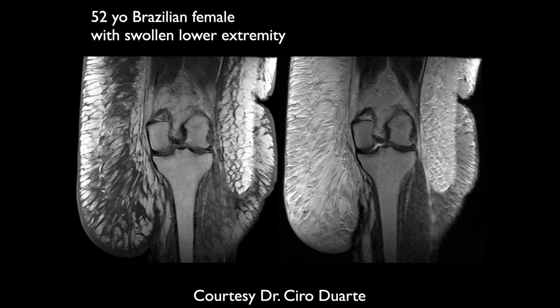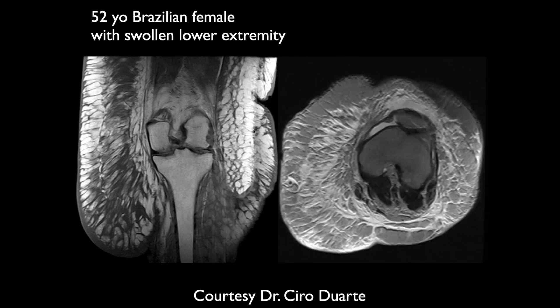Similarly, a 52-year-old Brazilian female with swelling of the lower extremity. There's marked edema, thickening, and enlargement of the subcutaneous fat. With elephantiasis, it'd be more like lymphatic obstruction — it's more like lymph tissue — and that's correct.